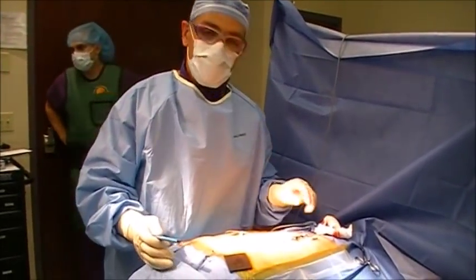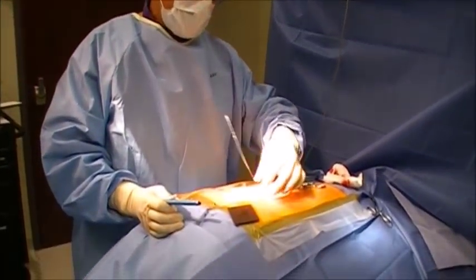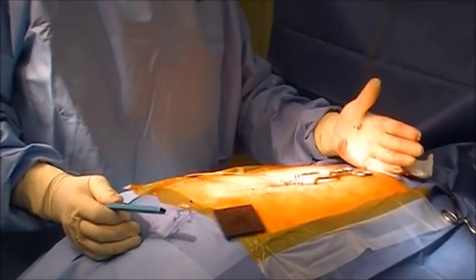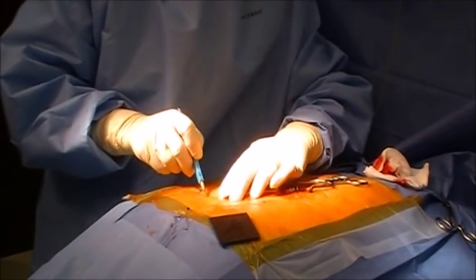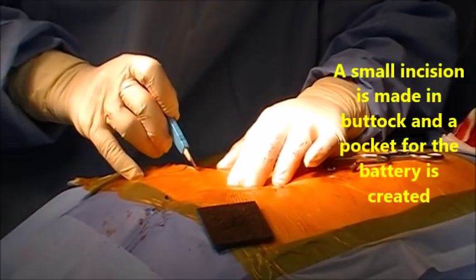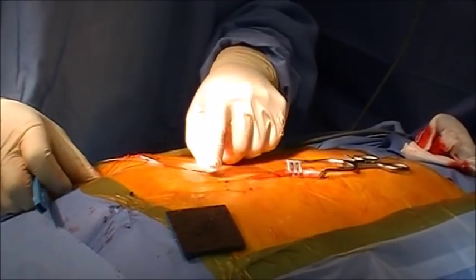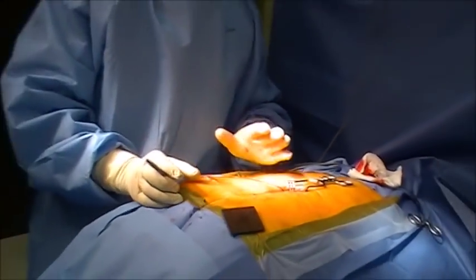I've created an incision in the back of her spine and anchored the wire down with an anchoring device to the supraspinous fascia, with the wire ending at approximately T8. Now I'm making an incision in the left buttock area to create a pocket for the battery, and I'll tunnel the lead with an extension cable underneath the skin connecting the two incisions.